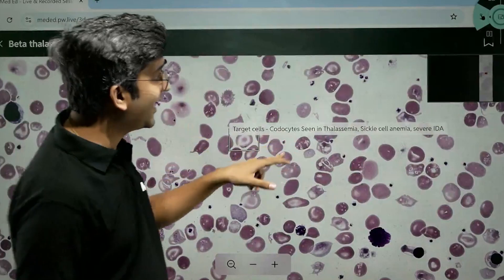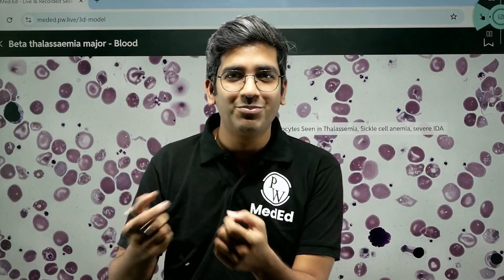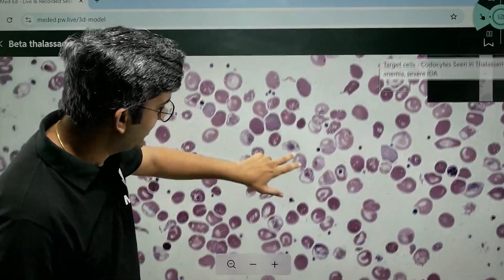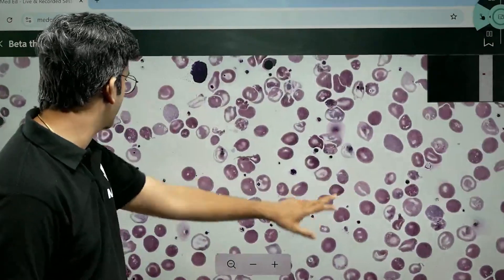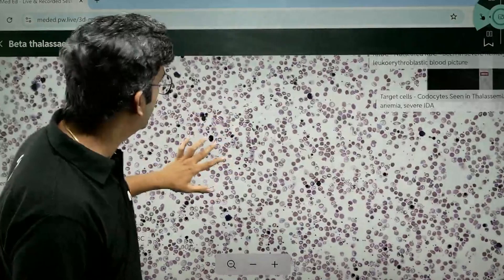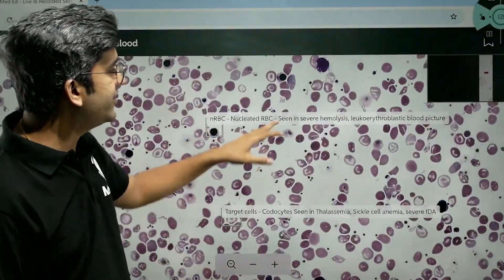Target cells — also called codocytes — are seen in thalassemia, sickle cell, and severe iron deficiency anemia. It's a compilation of information required for you in the form of an interactive experience — just zoom in wherever you want. You can see multiple target cells and easily identify the pale cells. There's also a nucleated RBC — NRBC — seen in hemolytic anemia and leukoerythroblastic picture. This is what the immersive slide learning experience is about.